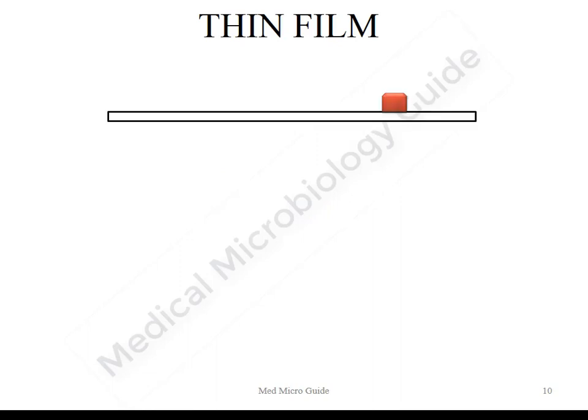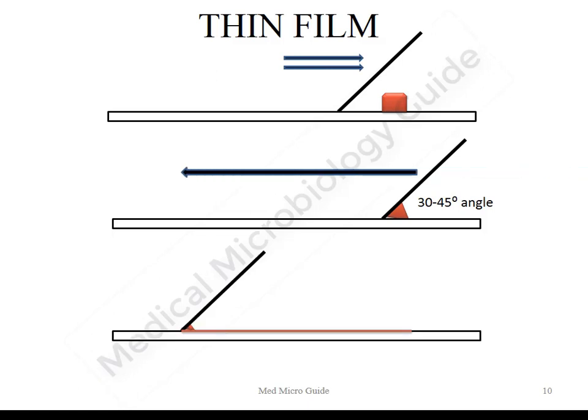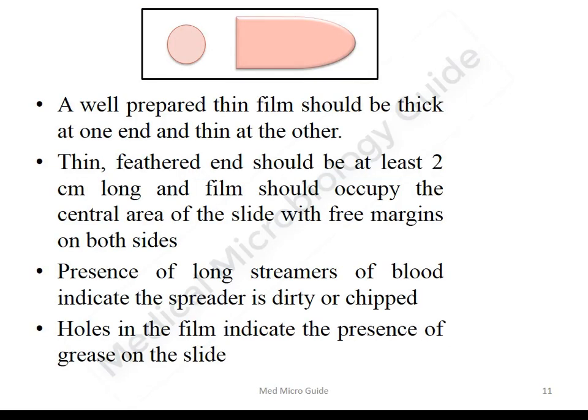The thin film is prepared by taking a drop of blood on a clean glass slide. Another slide, called the spreader slide, has a smooth margin at one end. The spreader slide is held at an angle of 30 to 45 degrees, pushed back to touch the drop of blood, then pushed forward to make a thin smear. A well-prepared thin smear should be thick at one end and thin at the other. The thin feathered end should be at least two centimeters long, and the film should occupy the central area of the slide with free margins on both sides.